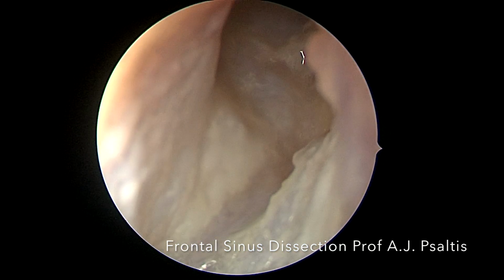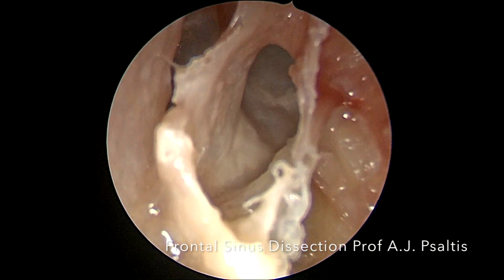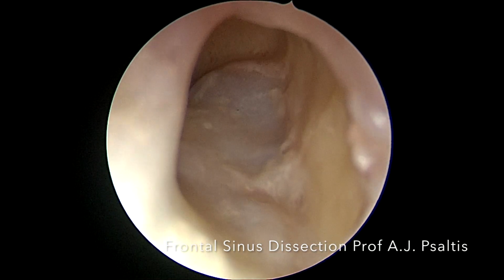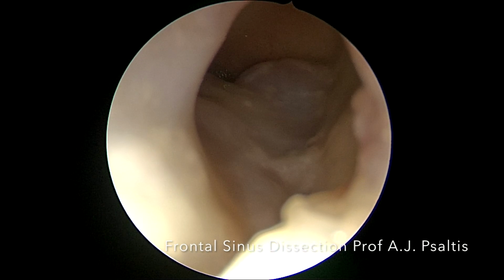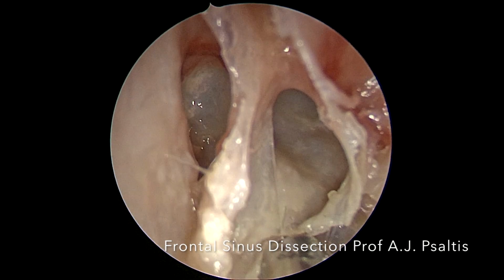Here we can see the beginning of the frontal sinus. We will need to change to a 30-degree scope to visualize the actual frontal sinus itself. And here we can see the roof of the frontal sinus and septations running within it.